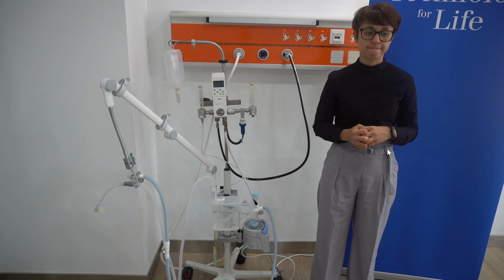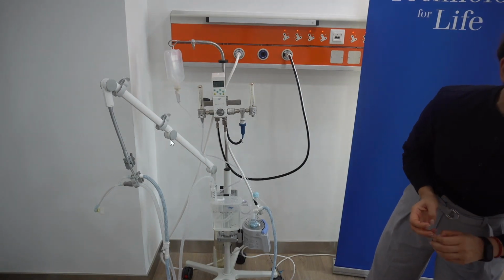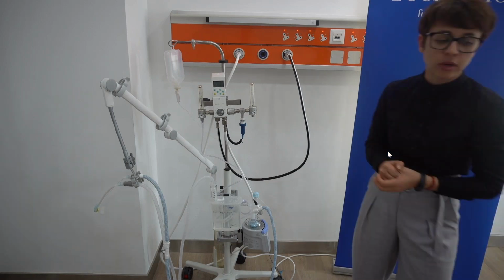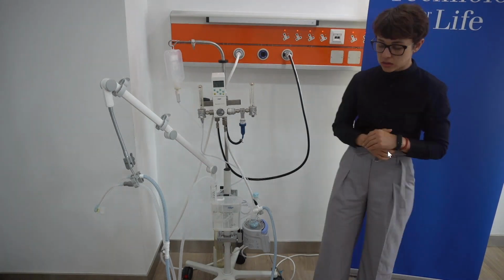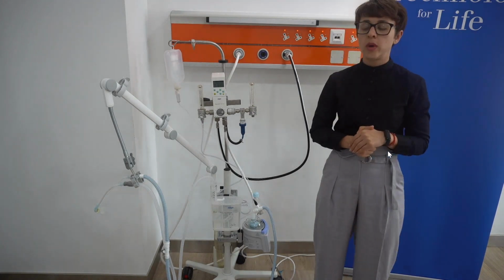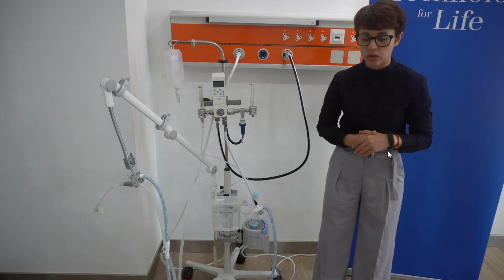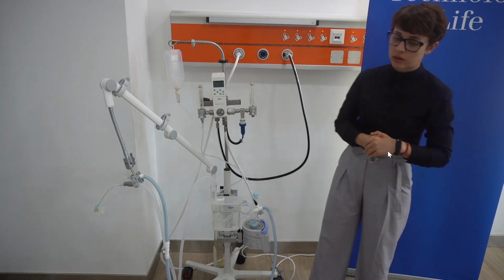Yes. Thank you, Linda. Okay, so the next question: do you recommend the bacterial filter in this ventilator for infectious cases? If yes, what is the appropriate part to install the bacterial filter? To be really honest, and Linda, you can also share your clinical experience, we do not tend to use filters on extremely preterm infants because of the increased resistance and, as a result, increased work of breathing.